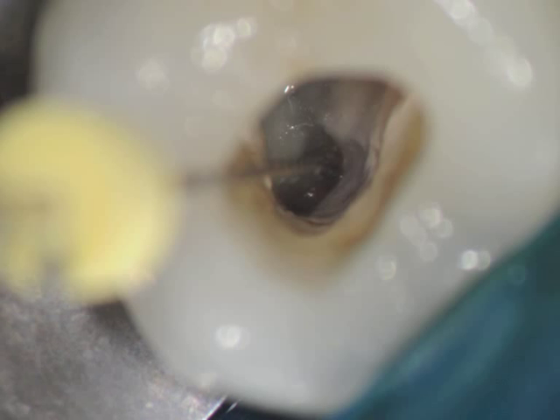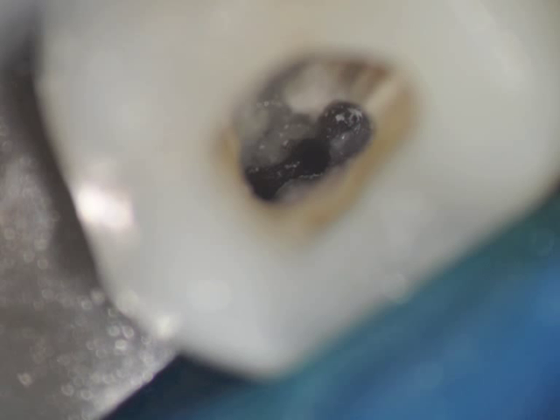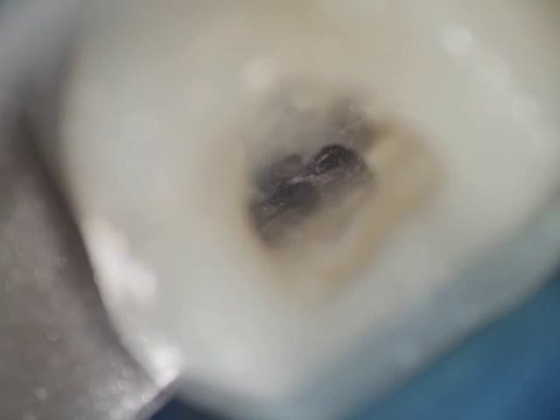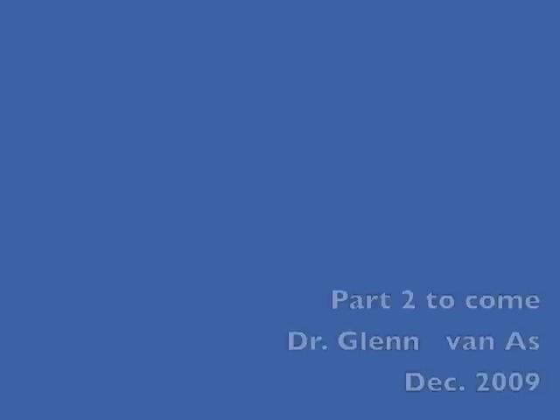As you'll see here now the fin is opened up. A number 8 file is put into the MB2, but surprisingly there's more tissue — a white line visible there. There is perhaps a possibility that an MB3 exists in this system. So we're cleaning it out and filled it with some calcium hydroxide. But as you can see there is the MB2, and perhaps palatal to it there is some more tissue and a further canal.